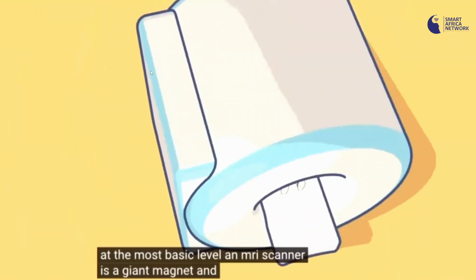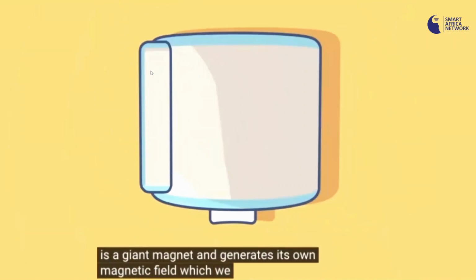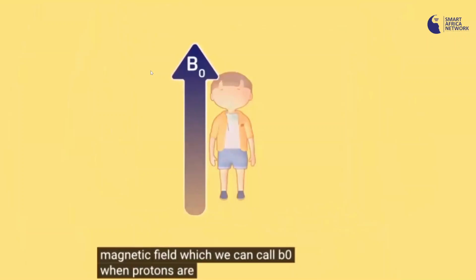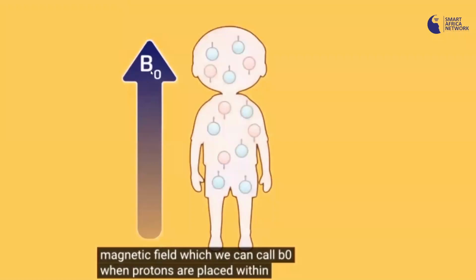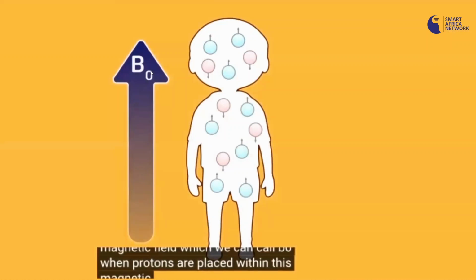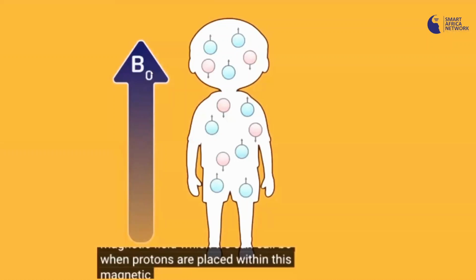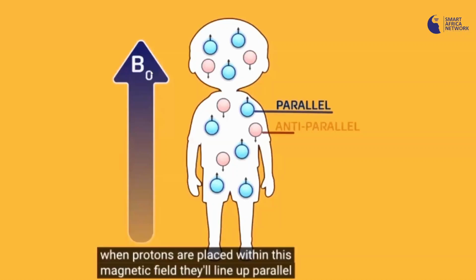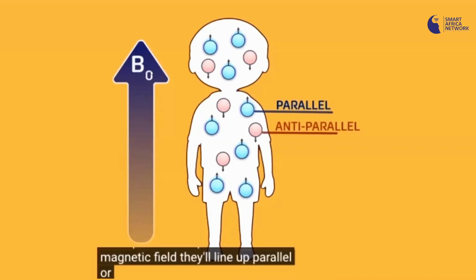At the most basic level, an MRI scanner is a giant magnet and generates its own magnetic field, which we can call B0. When protons are placed within this magnetic field, they'll line up parallel or anti-parallel to the primary magnetic field, with a small majority aligning with the direction of the primary magnetic field, just going with the flow.